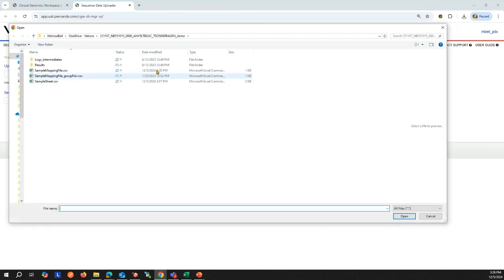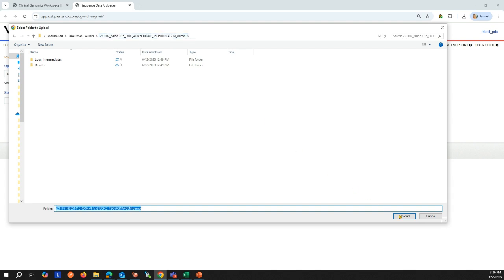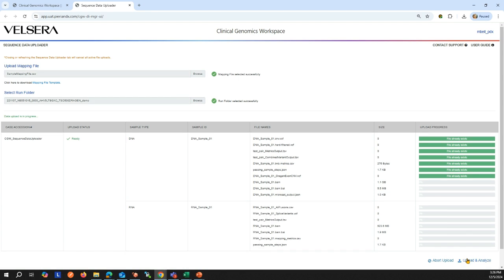If I go through the steps to start this upload again, you will see it has kept my place. I can begin the upload where it left off. Once the file is successful, you can close this browser tab. The case's analysis in CGW will launch automatically upon file upload completion.